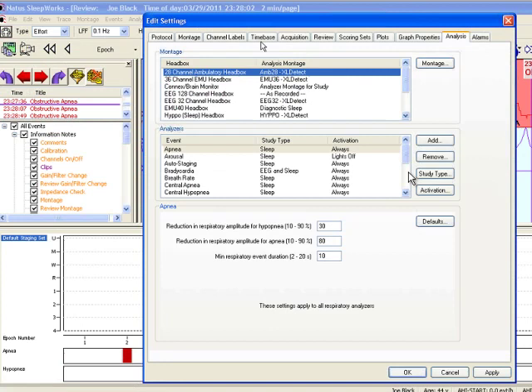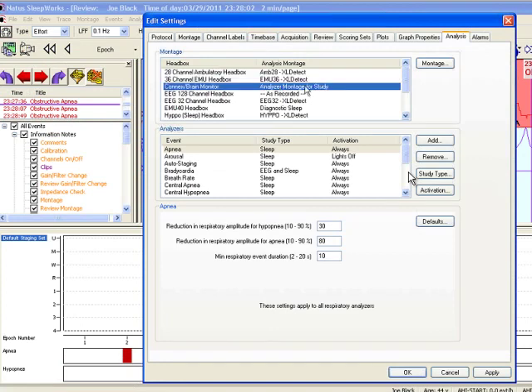Any settings that you have in this window here, for example, the fact that you've picked the select montage for this particular computer, and the fact that these analyzers are displayed in this window, this whole page, will not carry over to the other computers. You have to go on each computer and make the change.